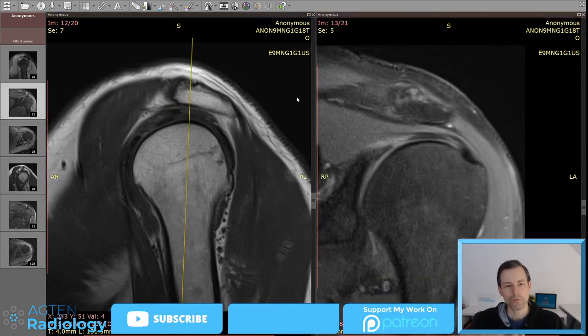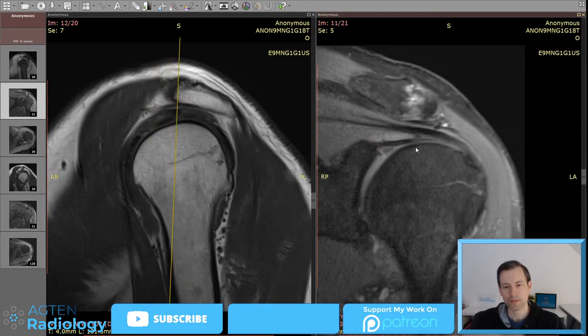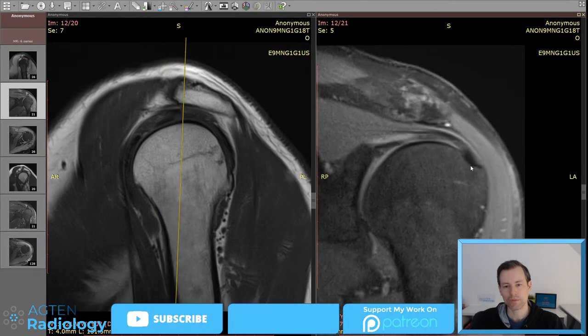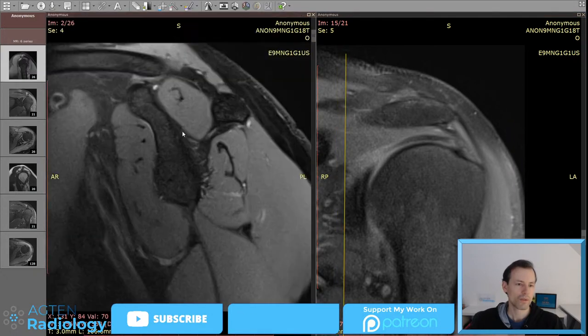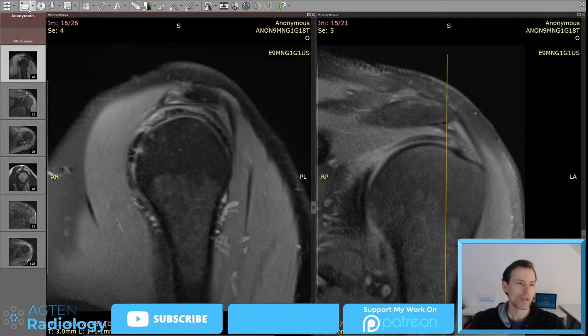Now, moving on to the tendons, that's the next thing on my list always. We can nicely see here the long head of the biceps tendon, then we have the superior facet here. Everything looking fine, and on the sagittal here, starting medially, we can also see there's not too much going on. And the age of the patient, just remember, it's 53.